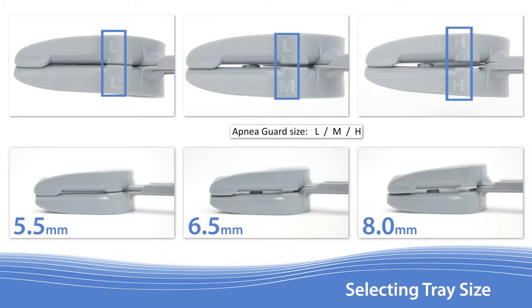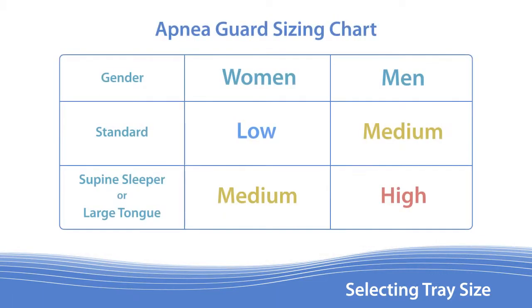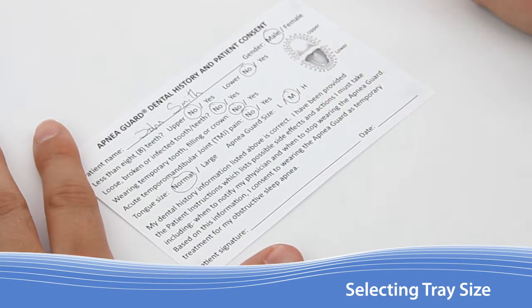Sizes can be found by examining the embossed lettering on the front corners of both upper and lower trays. Arrows can be found here that indicate which tray faces up. Use this chart as a guide for selecting the appropriate size Apnea Guard. Patients should be fitted with the smaller of the two sizes unless they will be sleeping regularly on their back or have a larger tongue. With the proper size now selected, circle the appropriate field on the dental history and patient consent form.